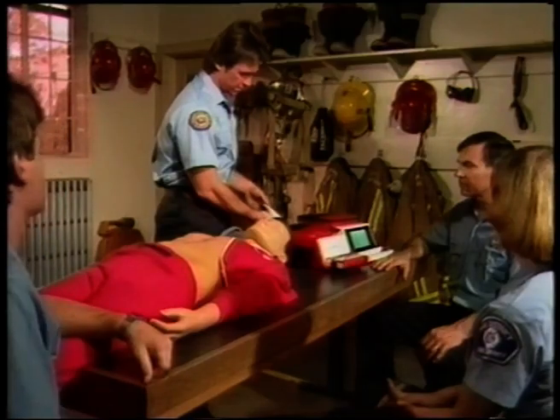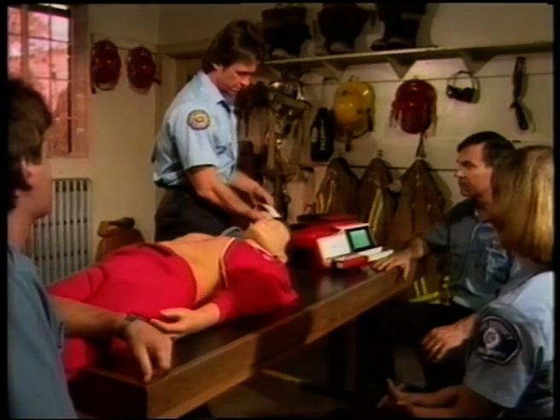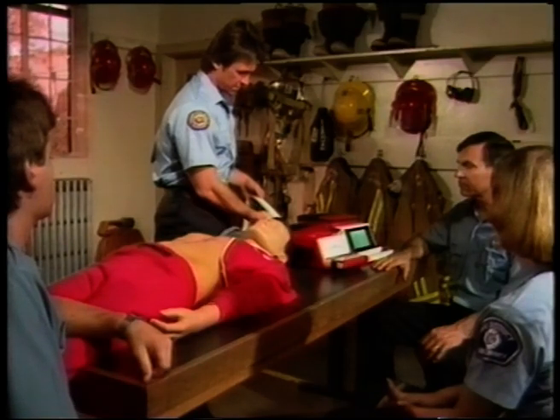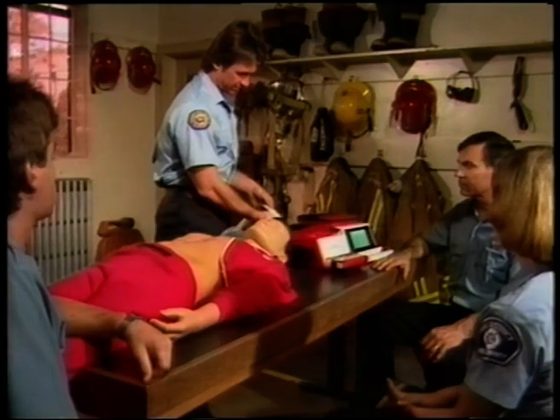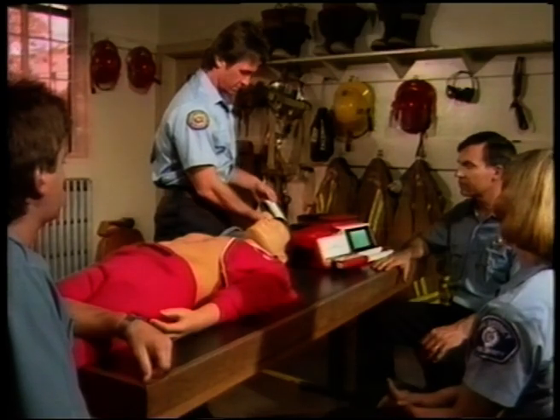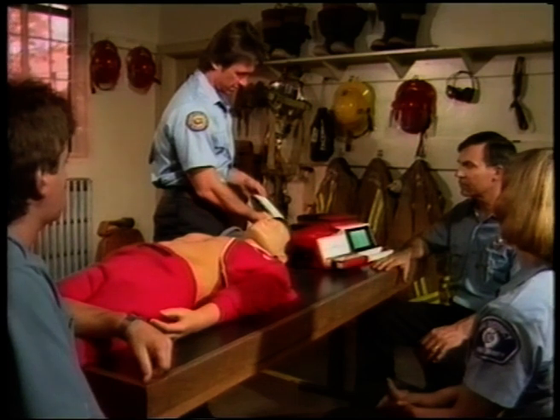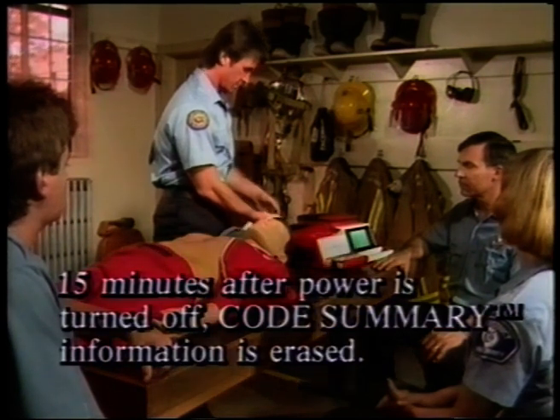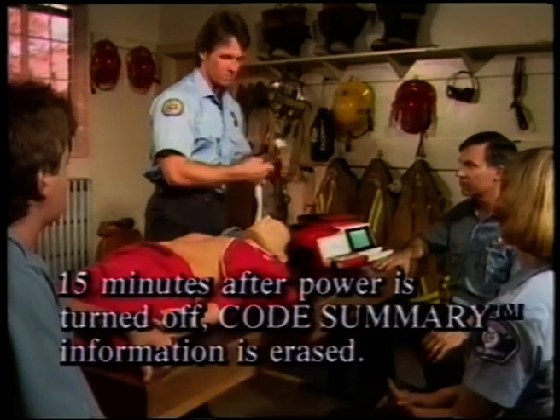When it's done printing, you will see Summary Completed printed on the end of the strip. You can make as many copies as you want. Printing Code Summary will not erase the stored information or interfere with other operations of the unit. The information is retained in the device for 15 minutes after the power is turned off and remains for that time even if the main battery is removed. After 15 minutes, the Code Summary information is erased in preparation for its next use.